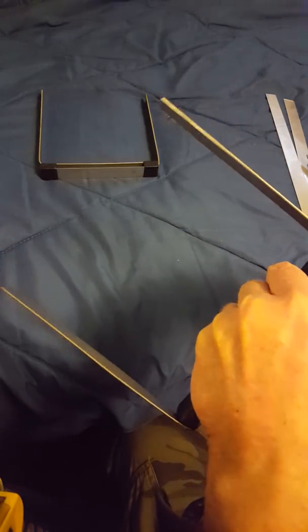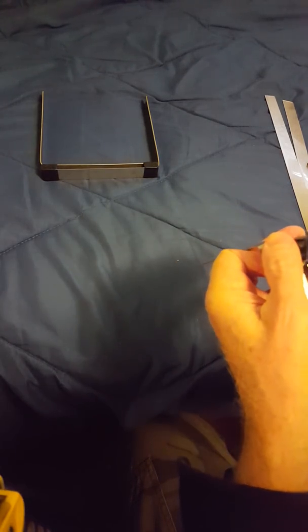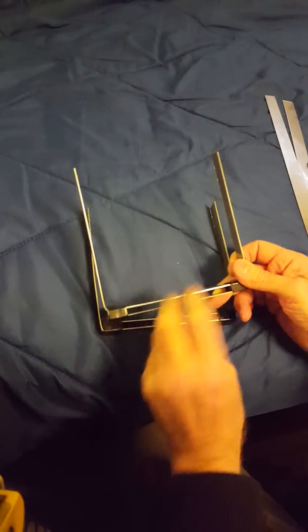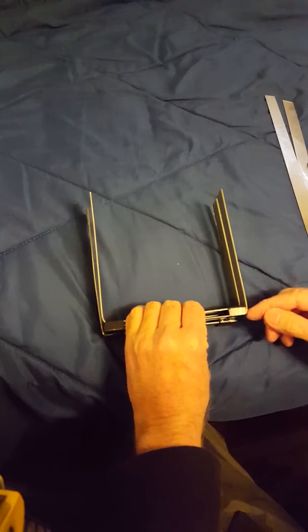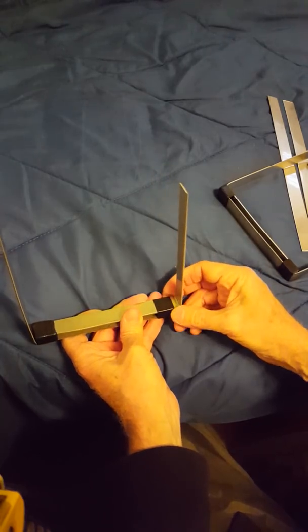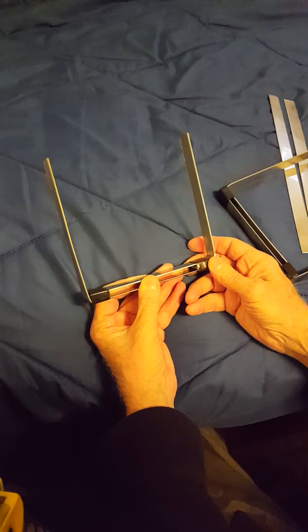Ah, it looks like one of my anvil bends is a little bit off. Oh well, it'll still work. Normally you can see that they curve back up here and both about the same. This one's got a little bit extra at the end here, but that's not gonna matter much. And that's how I make the electrodes. They're very simple to make.